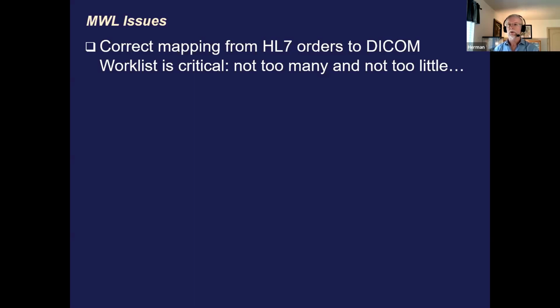So we go to a CT, and we have two CTs. Let's say a little bit sophisticated, a little bit big hospital. Maybe we have, I'll make it a little complicated, four different CTs. One in radiation therapy, oncology, one in outpatient, and two in inpatient. So when you call the worklist for CT, you don't want to see all four. Right?